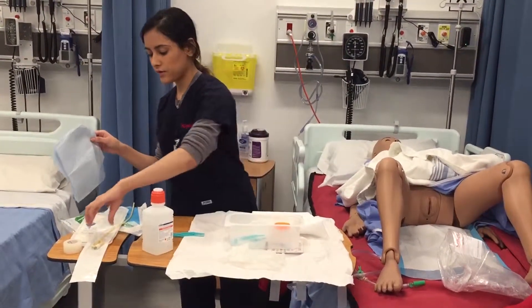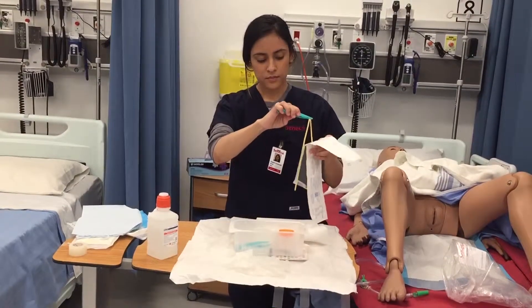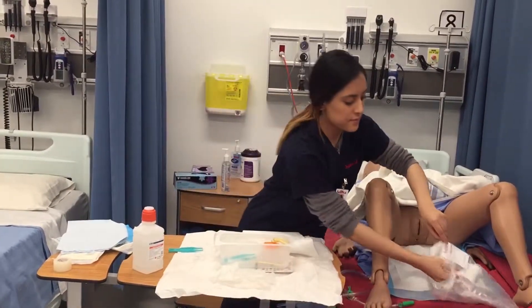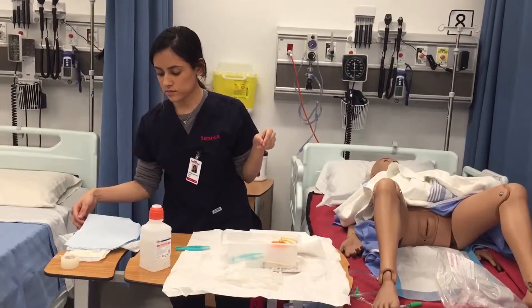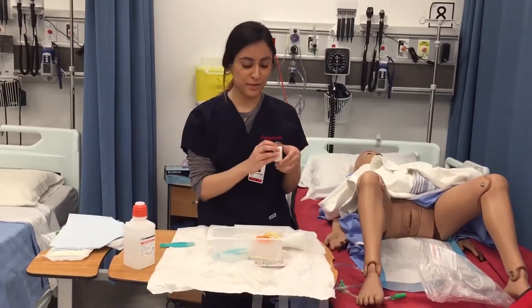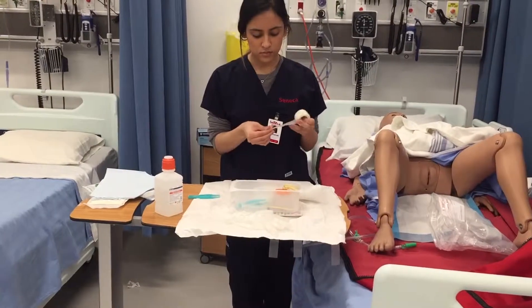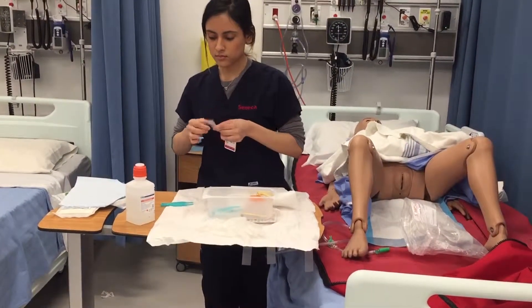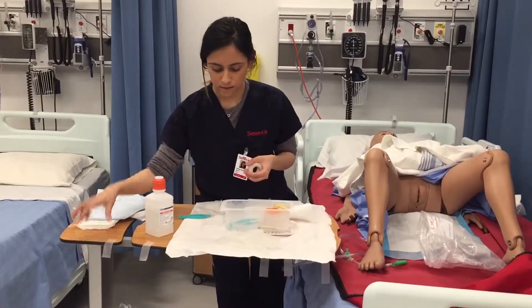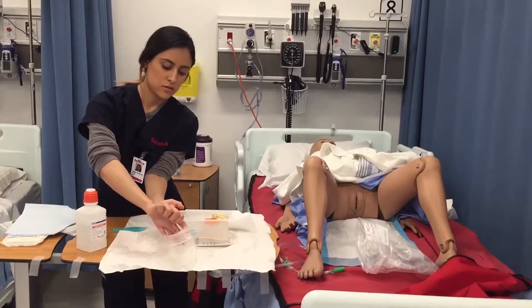Before putting on my gloves, I'm going to get the catheter ready — I'm going to banana peel it open and pull out the catheter. This is just going to go straight. I'm going to get my tape ready before I put on my gloves. Now I'm putting on my gloves, touching only the inside.